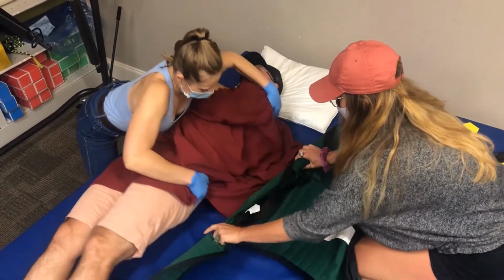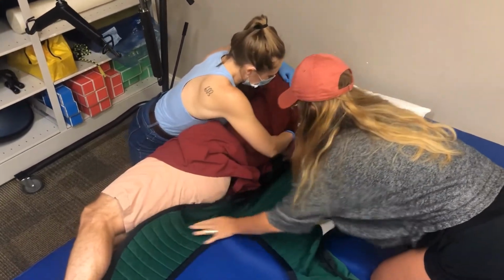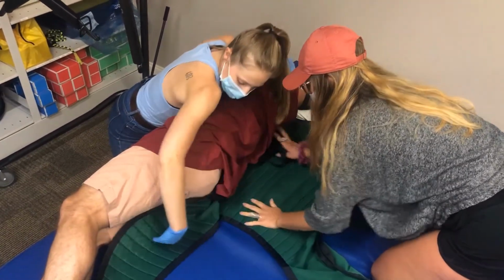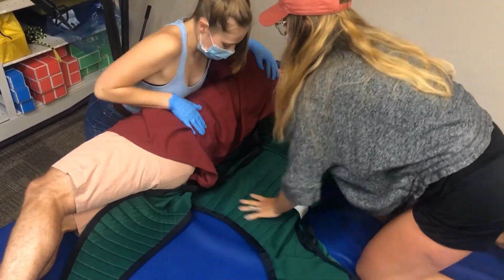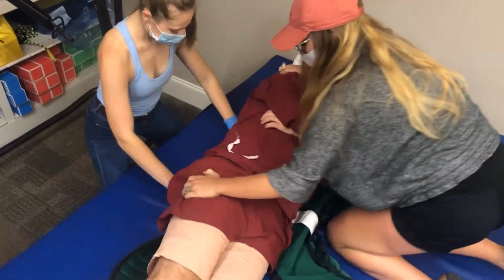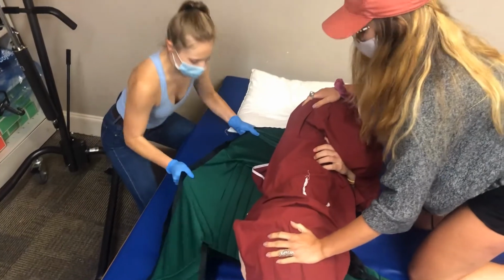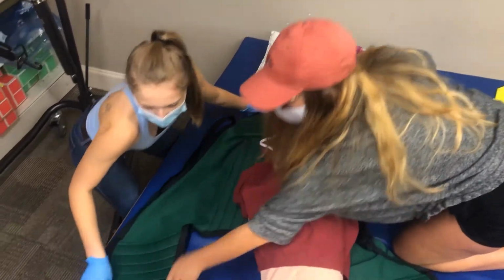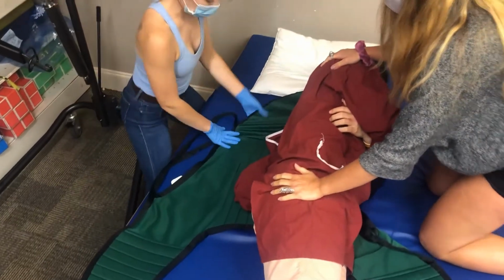Begin by scrunching up half of the sling. Roll your loved one towards you and place the scrunched up sling under your loved one. Now, roll your loved one away from you and unroll the sling so that it is fully under them. You may adjust the sling as needed so that it covers them from head to buttock.